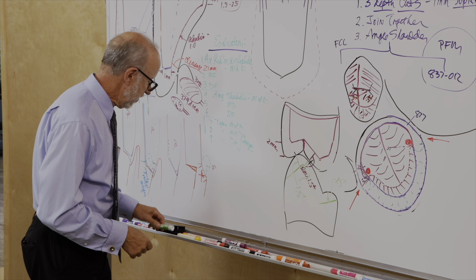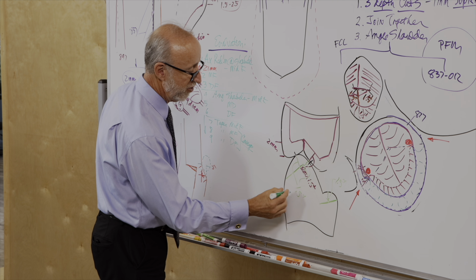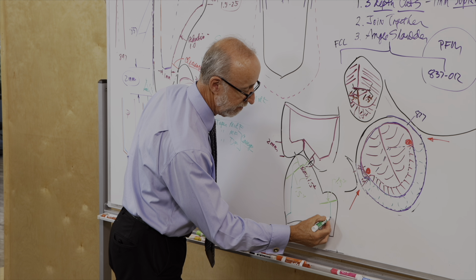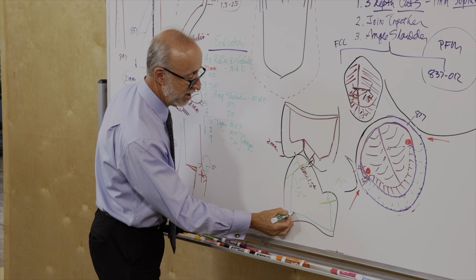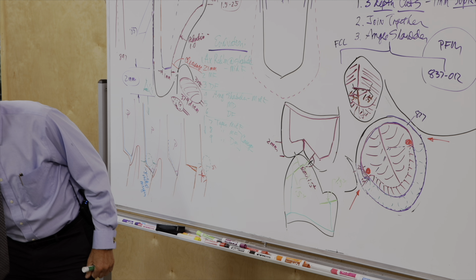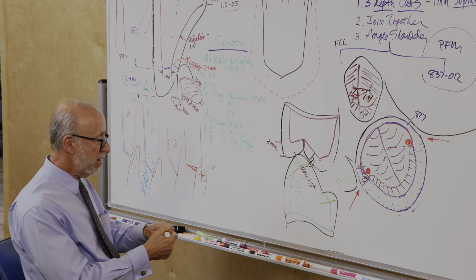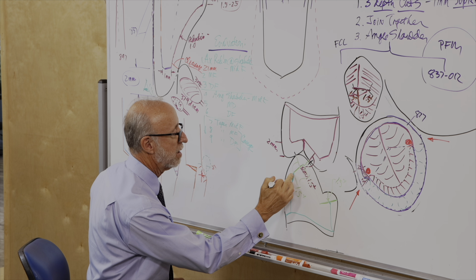And then once we've got those areas done, the rest of it's pretty straightforward. 3 depth cuts, join together, angle of shoulder, secondary plane on the facial, chamfer on the lingual, bevel the lingual cusp, which is sharp, bring the chamfer through the proximal contact, join the shoulder on the facial. Okay, so that's all we have to do. So nothing much new compared to what we've already done here. On the lower arch, you know, be careful that that secondary plane might have been a little bit angled wrong.